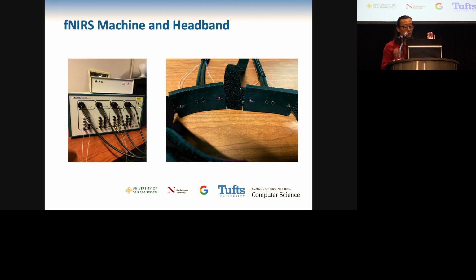As you can see, the image on the left is our NIRS machine, and on the right is the prototype headband we are using now. We put it on our forehead to get the information from our prefrontal cortex.